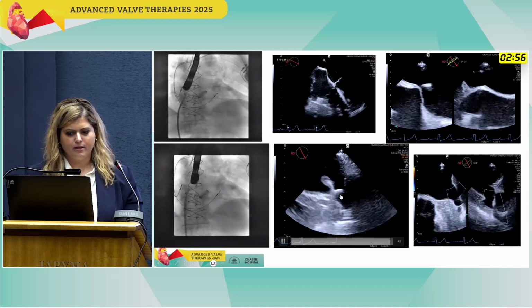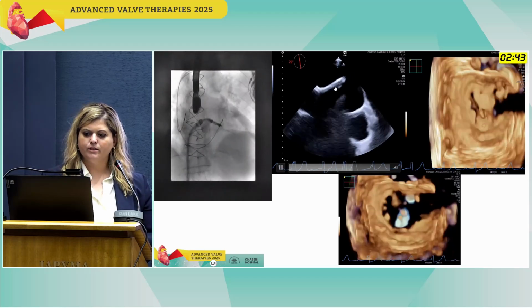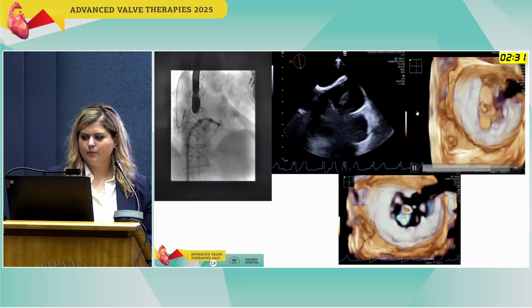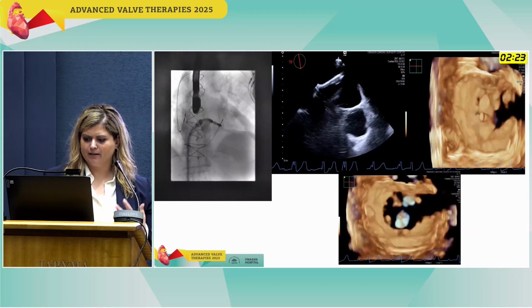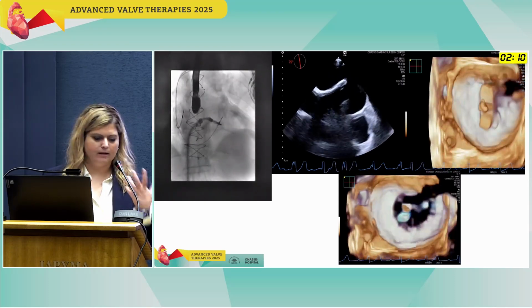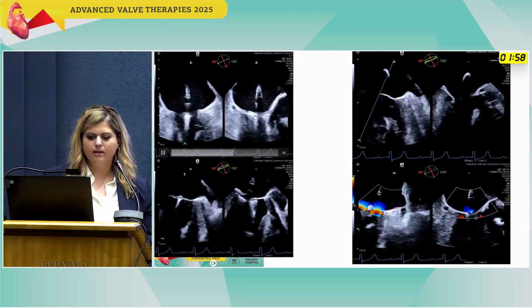Here under fluoroscopy, and here you see the echo result. Afterwards, over the wire, we went upwards with the MitraClip guide, and through the guide, of course, we delivered the XTW clip. After that we went down through the valve, and under 3D reconstruction we tried to position the clip directly on the P2 flail. Of course, we also control it here in this picture underneath the valve. After we dive into the left ventricle, we did the last orientation before we go upwards to the valve. As you can see in these two videos, both leaflets are nicely in the clip.